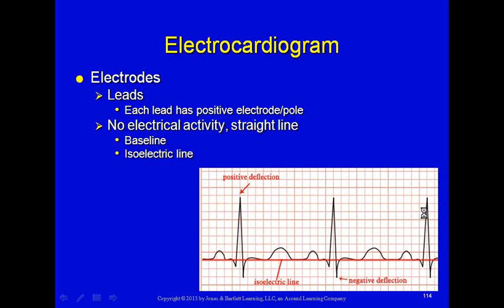And the reason that this is important is that we learn all our rhythms, or we'll be learning all our rhythms, in lead 2.